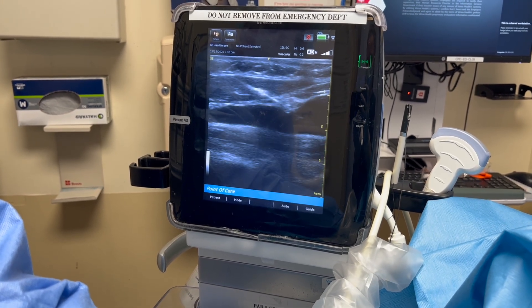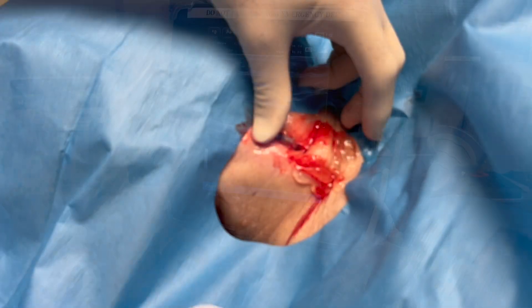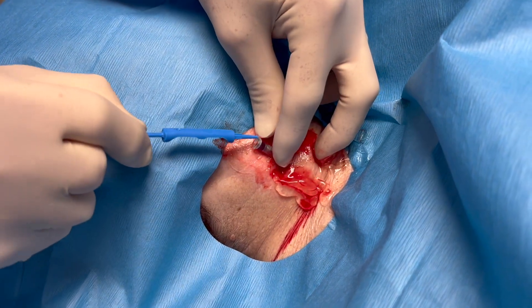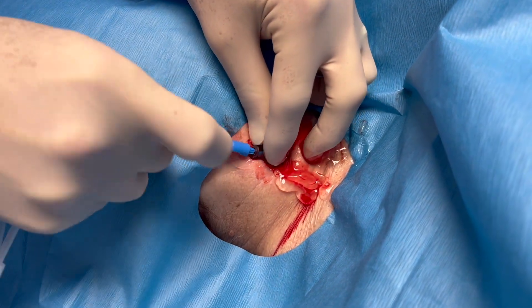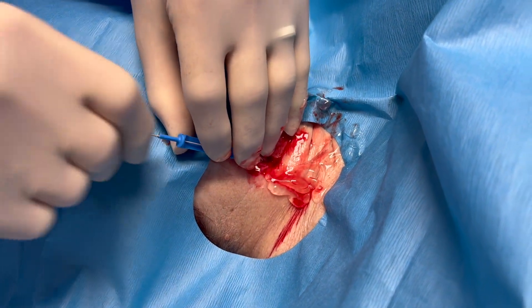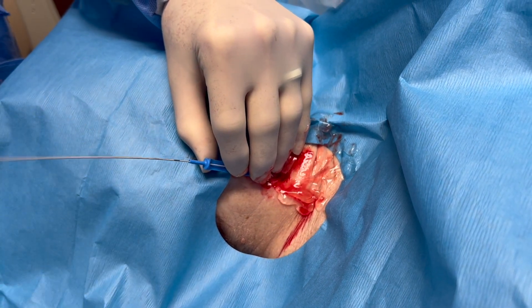Once I slide the catheter off, it's a little bit more convenient to control it — just put your thumb over it. The wire itself usually has a J-tip to it. I don't use my thumb to put the wire in; I usually just push the wire with my hand. This makes it a little bit easier to feel if the wire is misplaced and doesn't thread in easily.